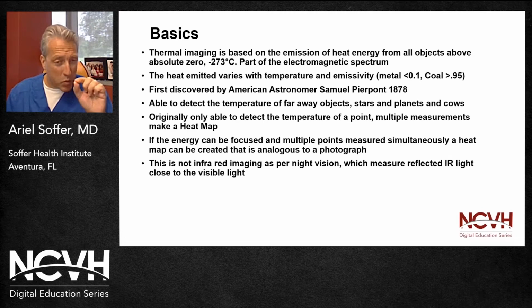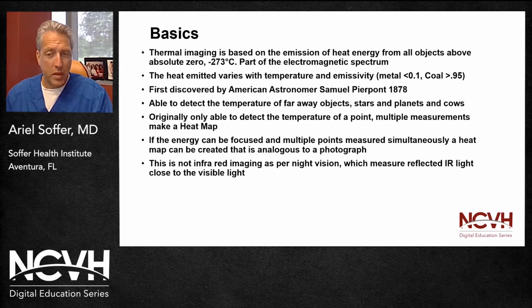Originally, we were only able to detect one spot, but then once multiple measurements started to be done, we started creating a heat map. And if the energy can be focused on a bunch of those multiple points, and they're measured simultaneously, a heat map can be created that is basically analogous to a photograph. So it's something that we're used to seeing.